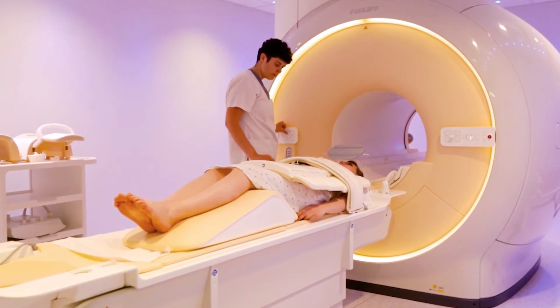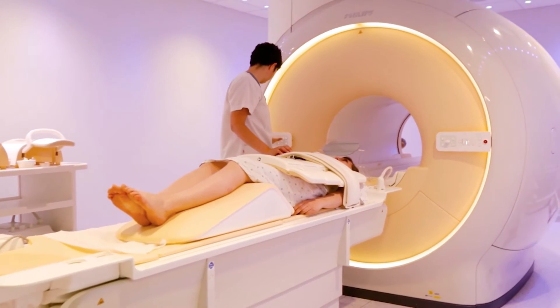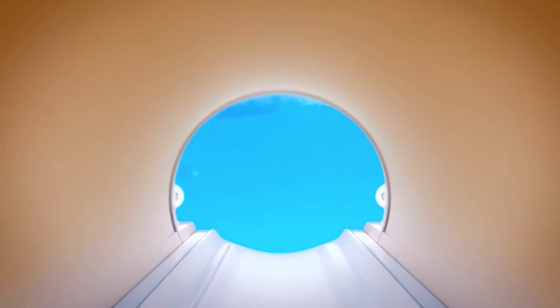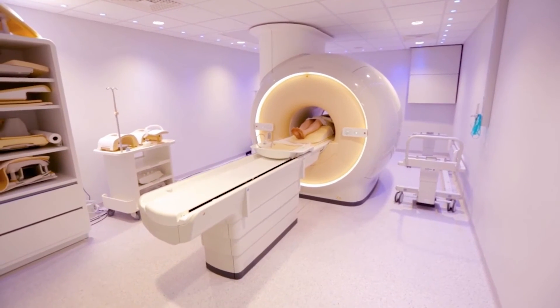The patient's body consists largely of water. The magnetic field causes the hydrogen protons in the water to polarize and point toward either the patient's head or feet. Pairs of protons pointing in opposite directions cancel each other out, while a much smaller number of unmatched protons do not.